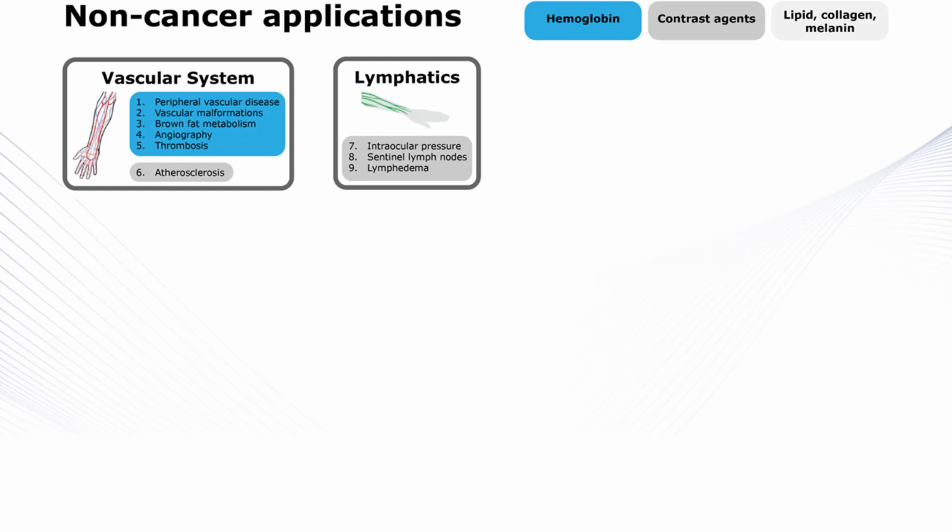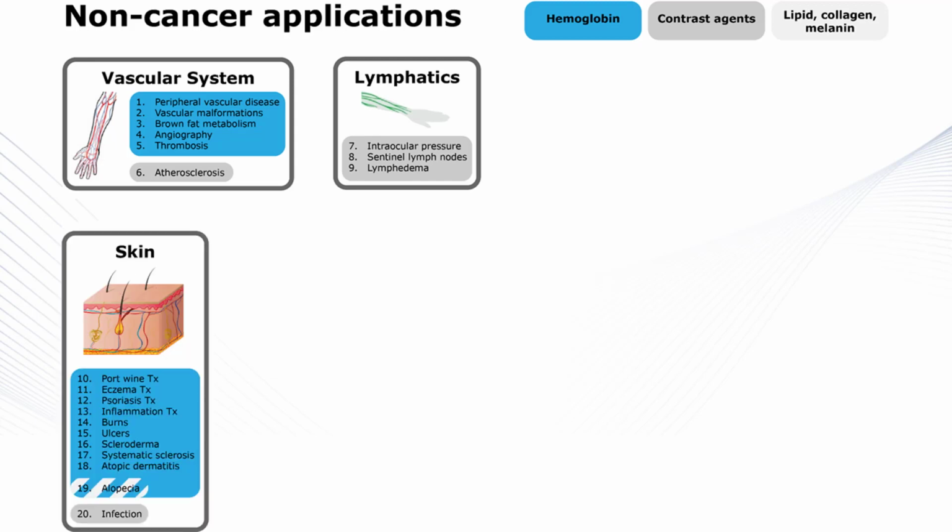But in many cases, you might want to look at lymph nodes either in that context or in the lymphedema case, where clinicians may need to visualize lymphatic vessels ahead of surgical intervention so that they know how to plan their surgery. This can be done as well with optical imaging, although in that case it can be difficult with dermal backflow to see underlying lymphatic vessels. There was a publication on this just a few weeks ago.